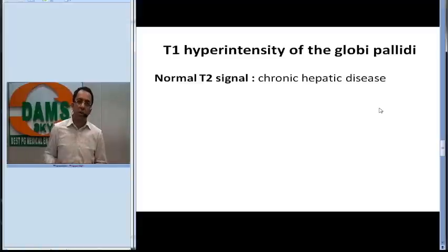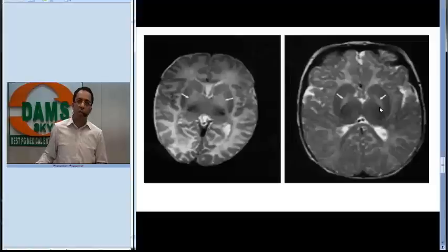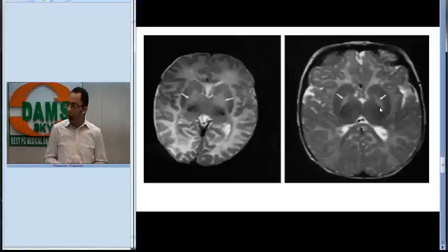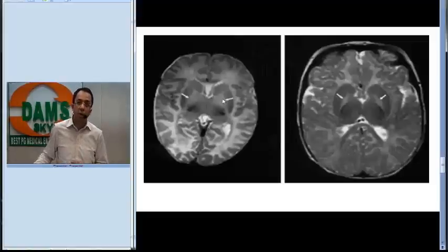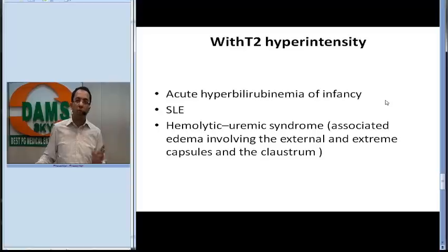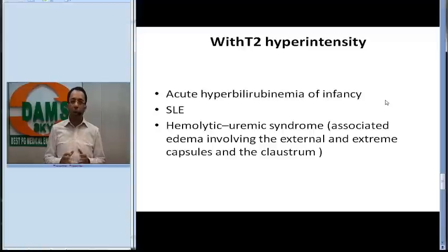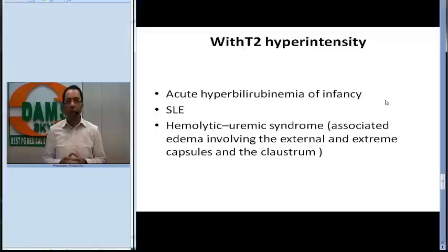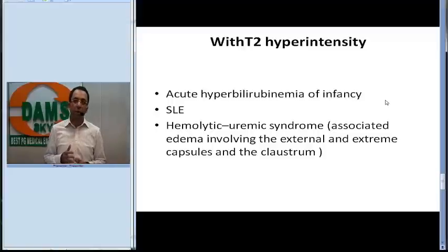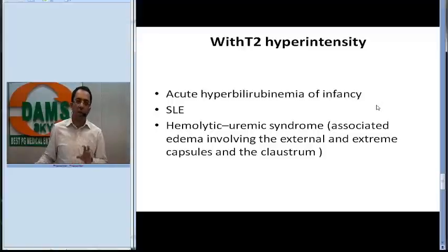However, if we compare with another patient who shows hyperintense signal on both T1 and T2-weighted images, we think of disorders like acute hyperbilirubinemia of infancy, SLE, and hemolytic uremic syndrome. A key point to remember is that in hemolytic uremic syndrome there is also associated edema in the external capsule, extreme capsule, and the claustrum area.